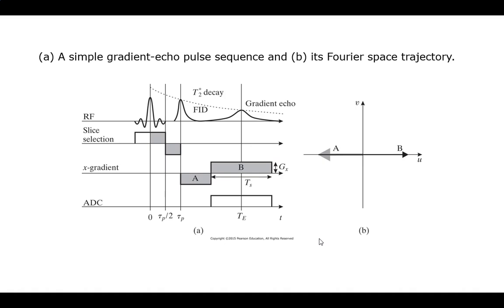So again, kick, resonance, wait till it's ready. Now, I put this one in the negative direction of whatever it is, and it basically excites everybody backwards. This one is in the X, so it's going to move me backwards in the X.